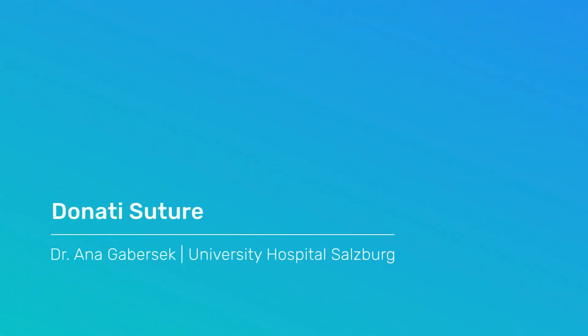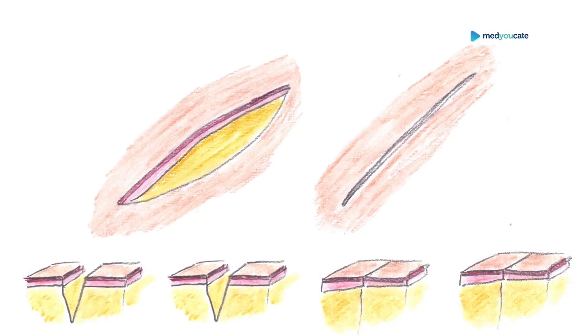Welcome to our next medyoucate video on basic surgical techniques. In this video we will demonstrate Donati Suture. We are going to demonstrate two surgical sutures: Donati Suture and Allgöwer Suture. The Donati Suture is also known as the vertical mattress suture.